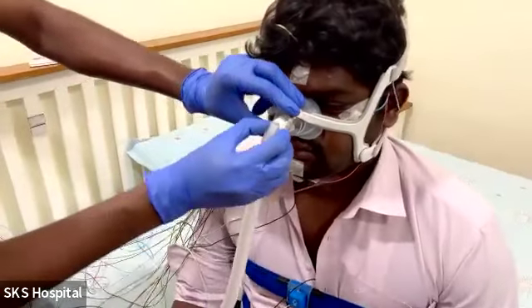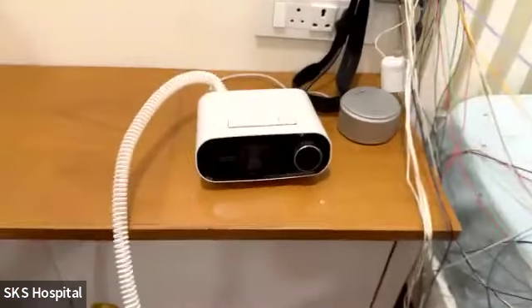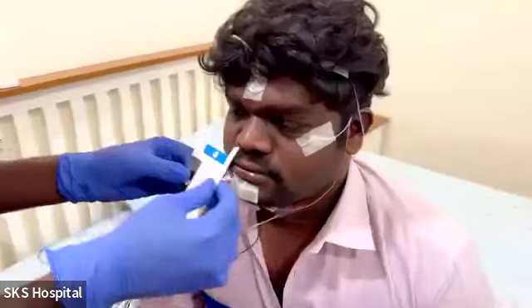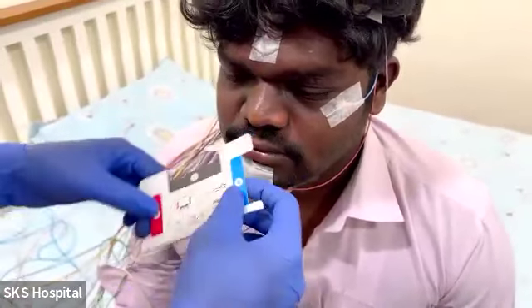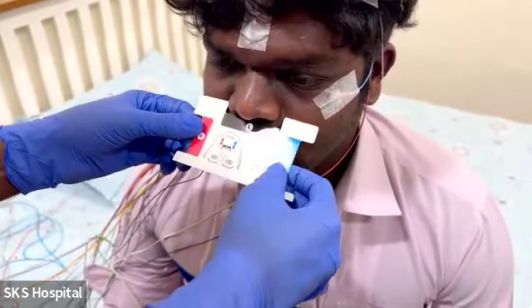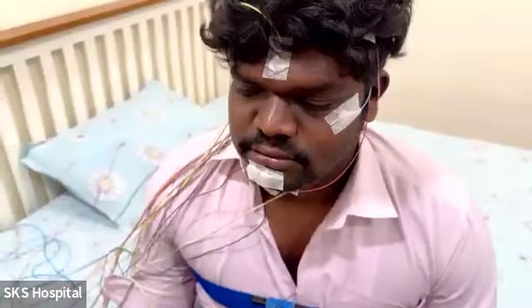The connecting tube is connected and fixed to the mask. The other end is connected to the PAP machine. How we connect the mask is by checking for the size, whether it is small, medium, or large, based on the mask company's recommendations. Each and every company will have different recommendations for size.